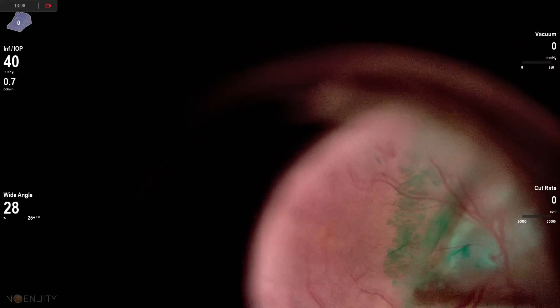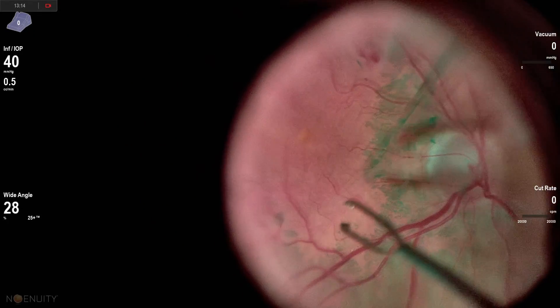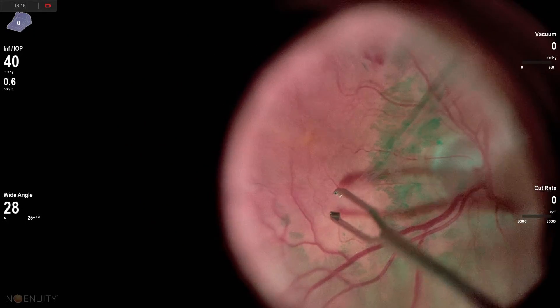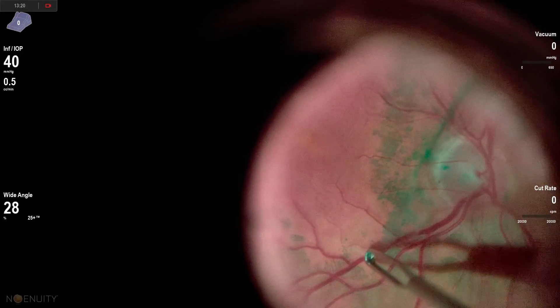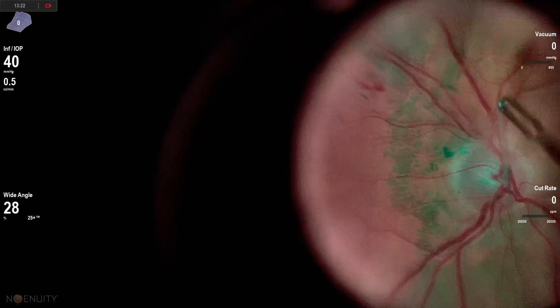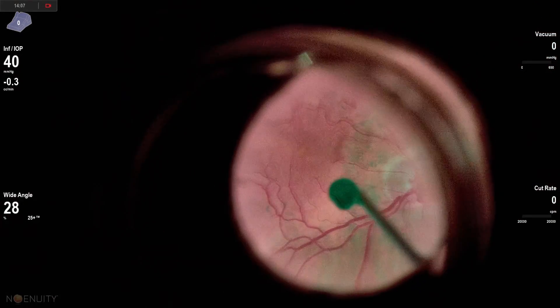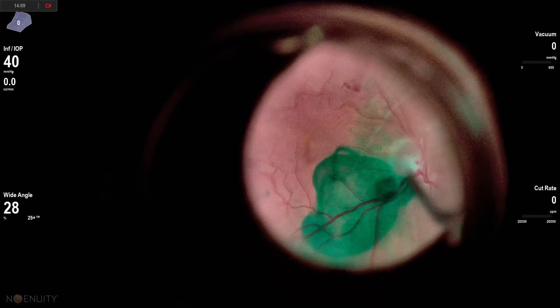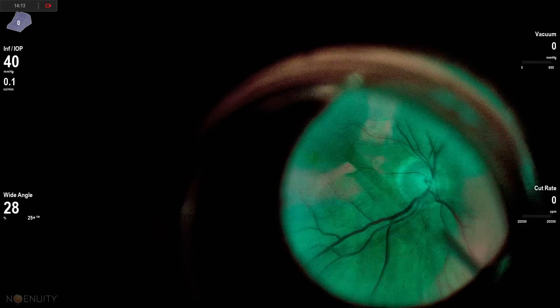You watch the edge as you release the epiretinal membrane or it slips out of your forceps so you know where to re-grab. I'm using the 44 Alcon in-grasping forceps — I find these are really good for ILM, which I'm going to peel after this, and pretty adequate for epiretinal membrane. The 13 forceps are a little better for epiretinal membranes, but in this case I want to go back and peel the ILM and these 44s are really great for that.